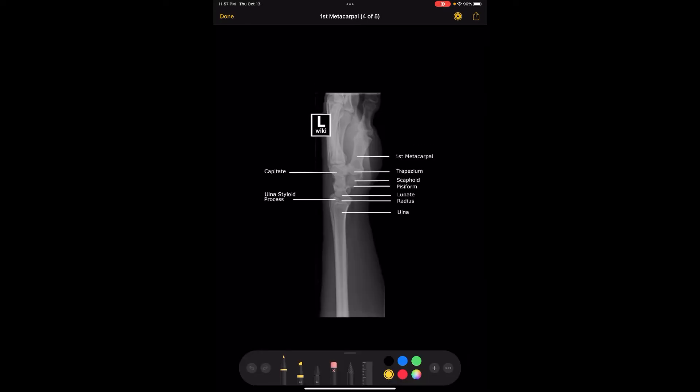The lateral view is very particular. The most important thing is to make sure that the radius and the ulna are totally superimposed over each other. Sometimes it's not going to be totally perfect, but you want it to be as close and as superimposed as possible. It's really challenging, especially when you're X-raying little kids, because it's not a very natural position. A lot of the times people under-rotate, so the ulna ends up here and the radius is kind of more in front, just because it's so uncomfortable for the patient.